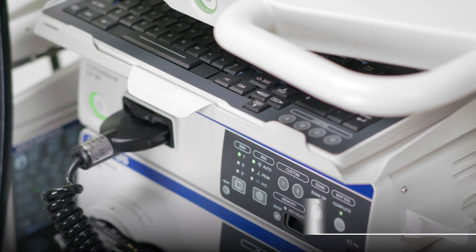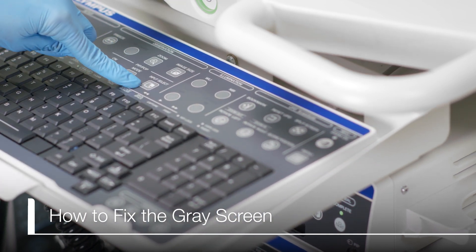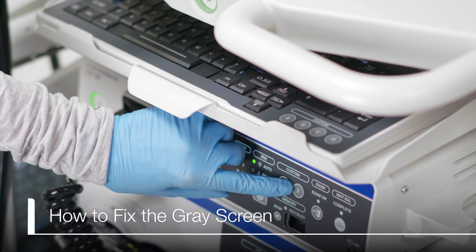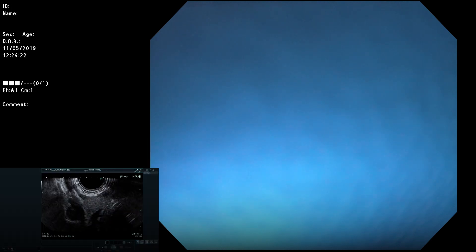If the sub-screen appears gray, press either the Input Select button on the CV190 keyboard or the Custom 2 button on the front of the CV190. The system will flip through the different input options each time either of these are pressed. Continue to press one of these buttons until the ultrasound image appears.